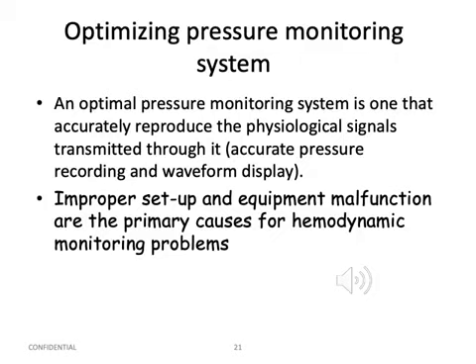المفروض إنه البريشر مونيتورينج سيستم الانفيزيف هو مفروض يعطينا more accurate reading. However it could be subjected to some, مثلا, improper setup, malfunction بالاكويبمنت، ممكن المونيتورنج systems يصير في عنا some technical problems، وهاي رح تعطينا inaccurate reading.